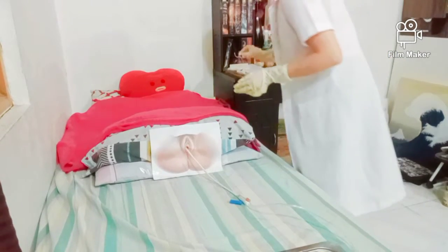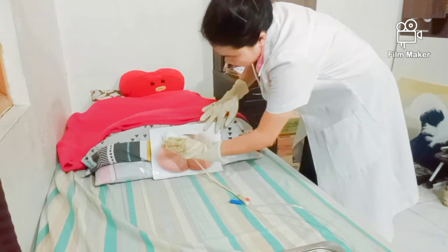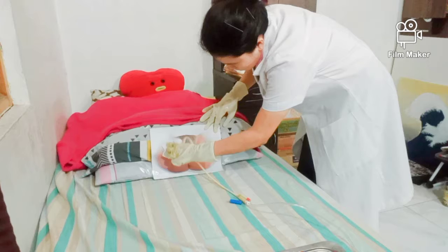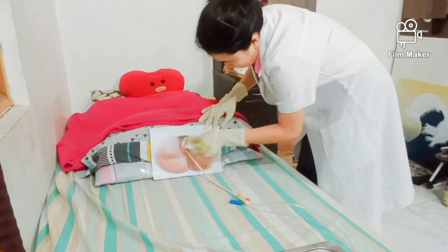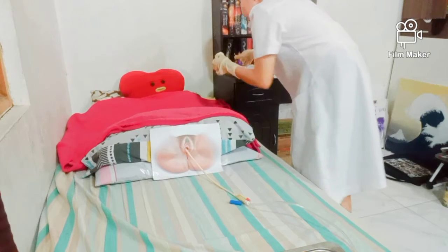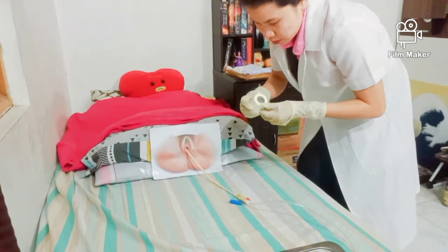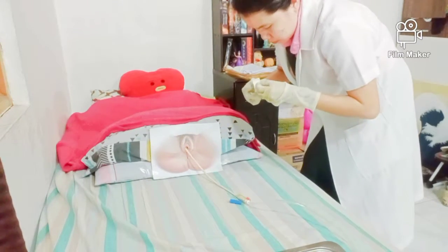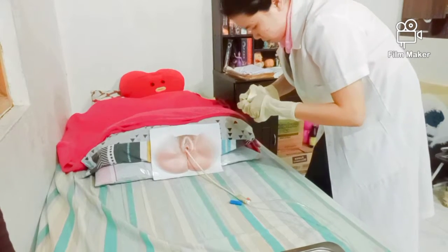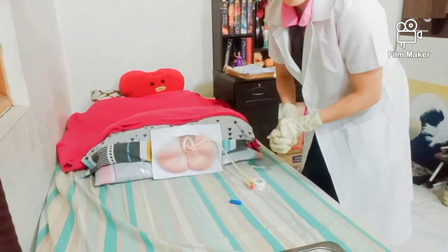Next, wipe the patient's genitalia to remove the excess lubricating jelly. Then get the plaster to tape the catheter to the thigh to secure it.